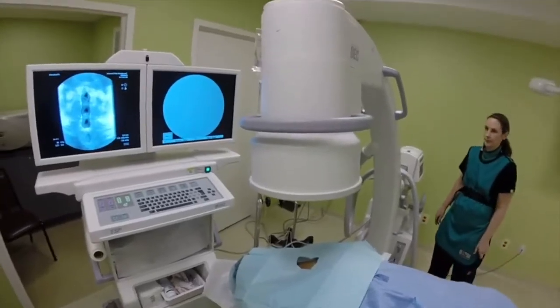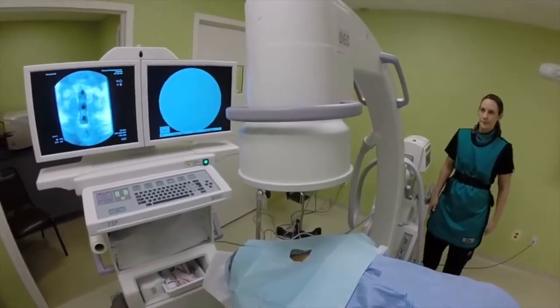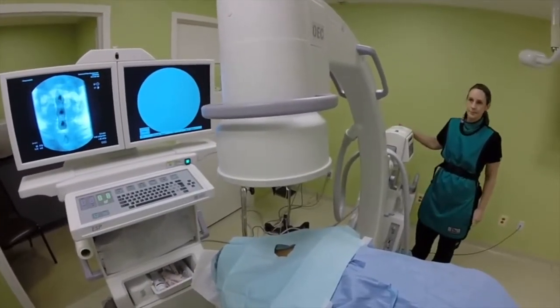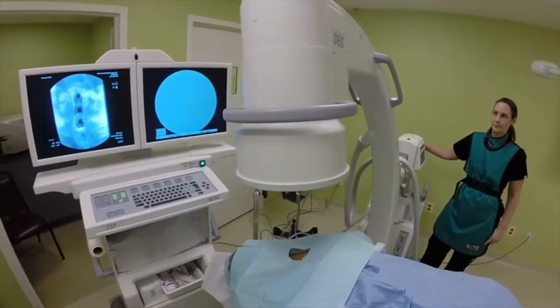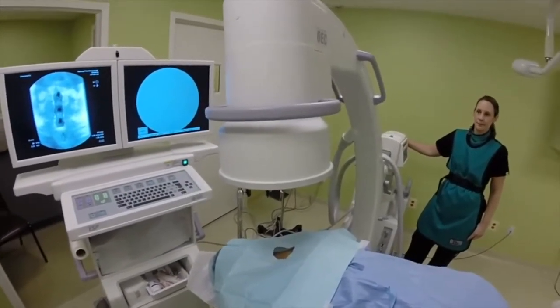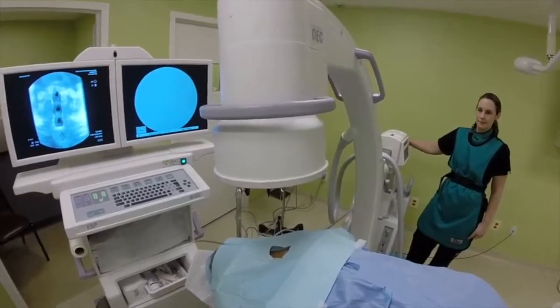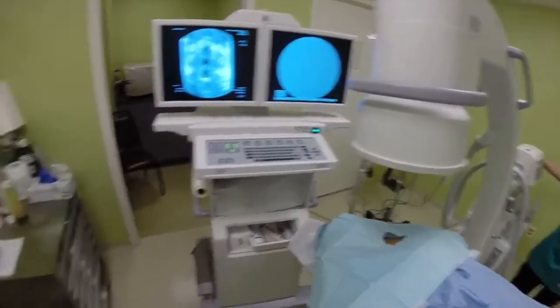I will start the presentation about contrast spray technique. I will do this technique for cervical epidural steroid injection and I will employ contralateral oblique fluoroscopy.